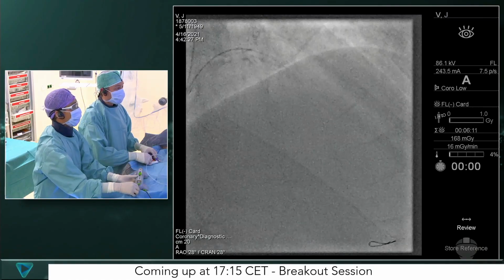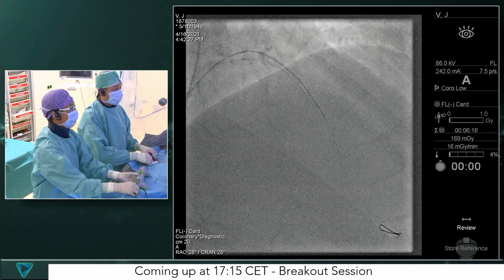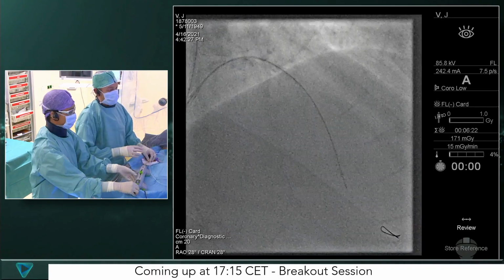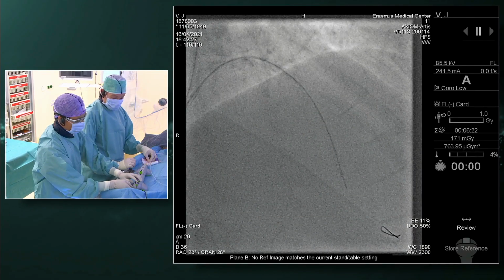If there's an area like this, you'd even burr through the area in the middle. I think with this device, you really wouldn't burr the area where there's no calcium. You try to burr the areas where there's calcium. So just walk us through what you're doing. Beautiful, exactly.